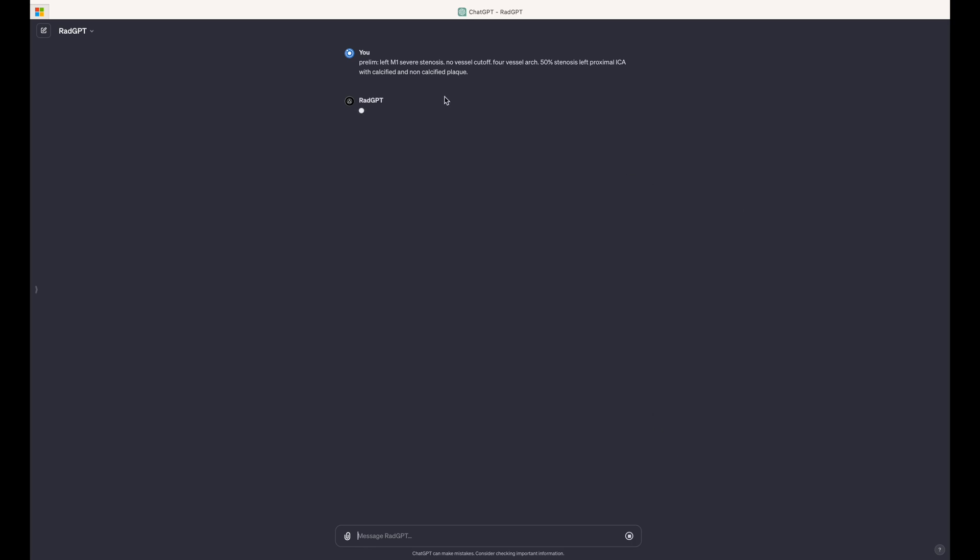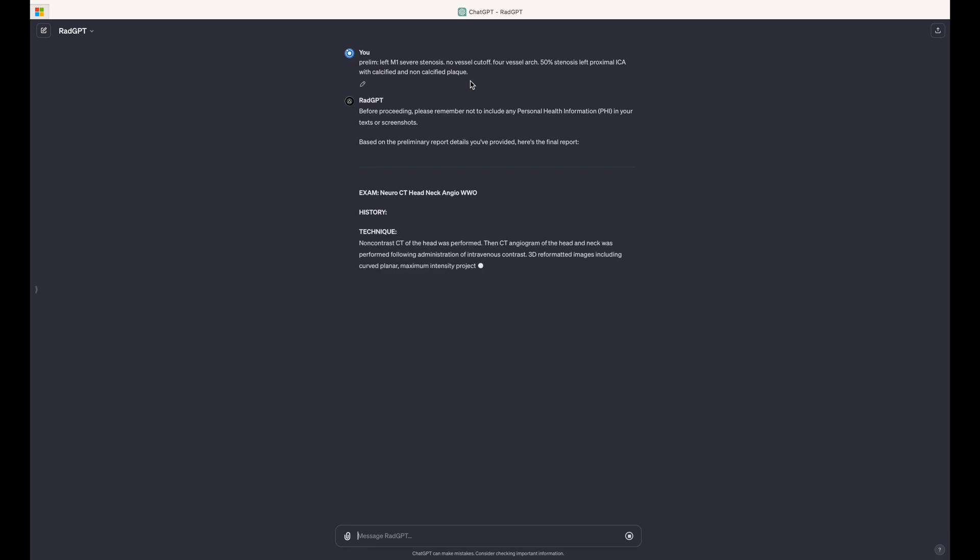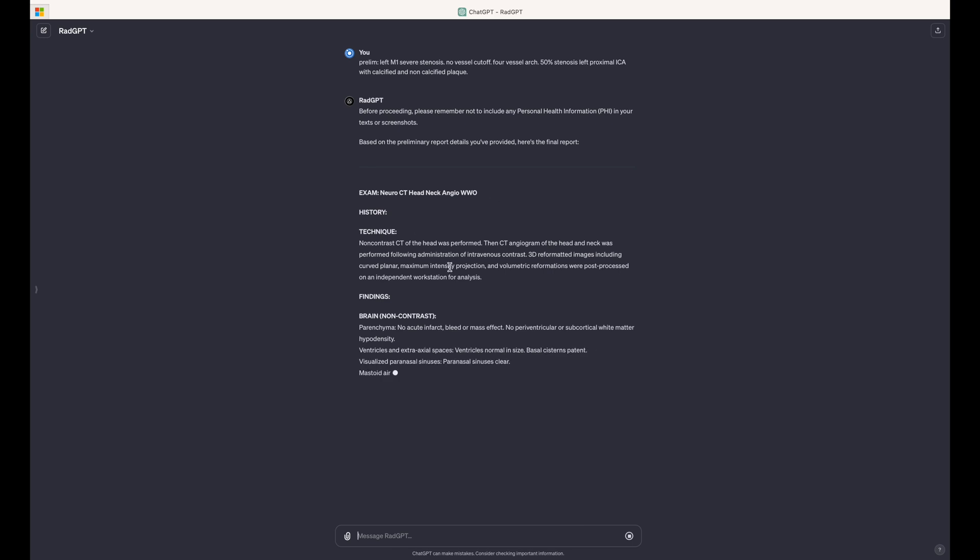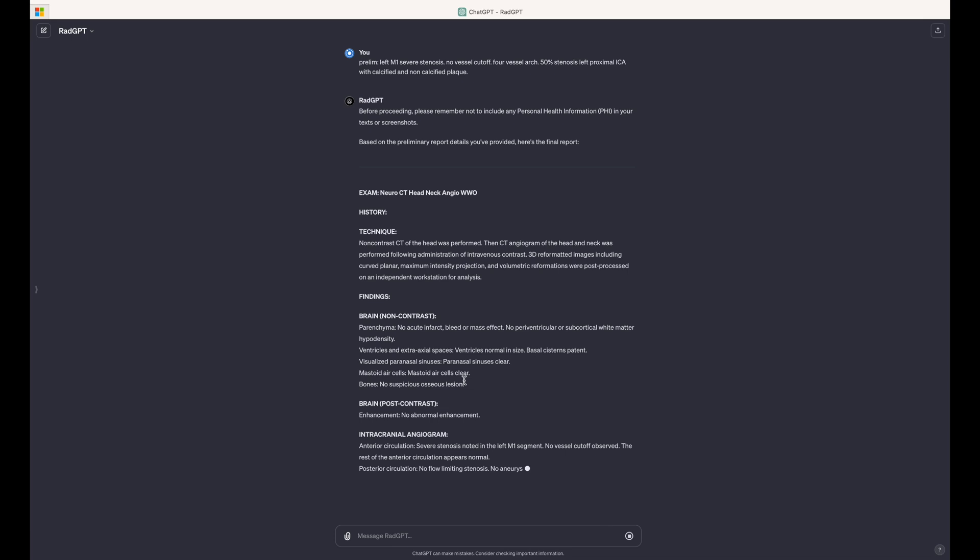You can see that it's providing findings related to the CTA head and neck, but I haven't told it that the study relates to a CTA head and neck. RadGPT is automatically matching that to a template for a CTA head and neck angiogram, including technique sections. It leaves the things that it doesn't know blank, like a history. And you can see the positive findings are being inserted at just the right place.